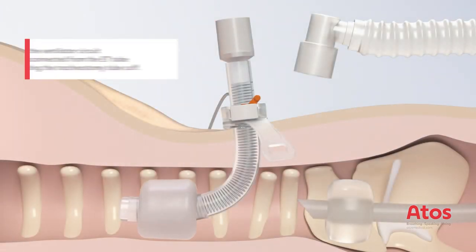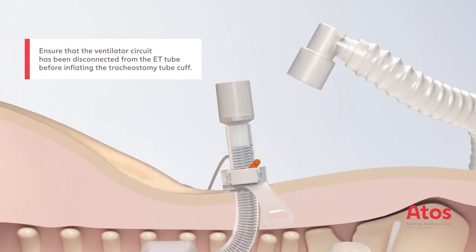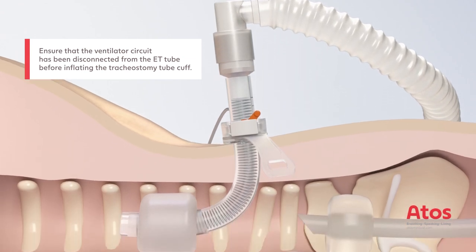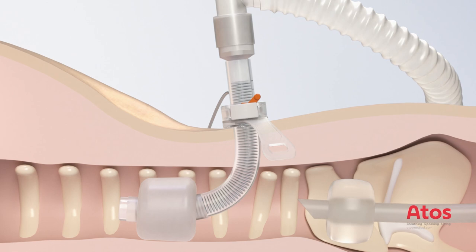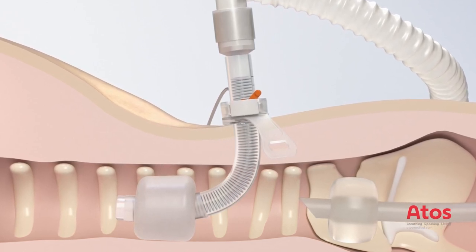Inflate the cuff of the tracheostomy tube, disconnect the ventilation tube from the ET tube, and attach it to the 15mm connector of the tracheostomy tube. The position of the tracheostomy tube is confirmed via the ventilatory circuit using a fiber optic camera.